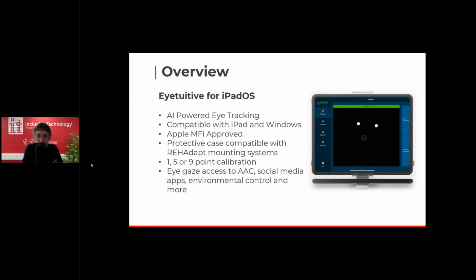As I mentioned before, in terms of iPad, it does need to be the iPad Pro 12.9 inch, at least third generation. Windows can be Windows 10 or 11. And it's MFI approved. So as I mentioned, future proof, and also the ability to control an iPad through Snap to Item.